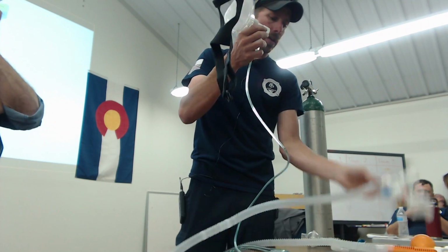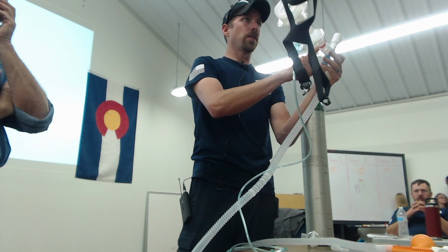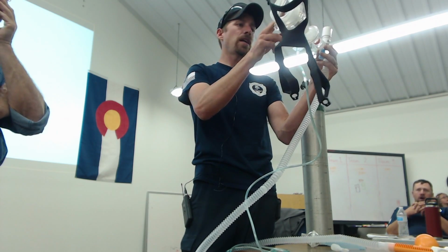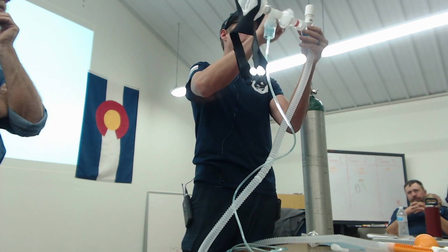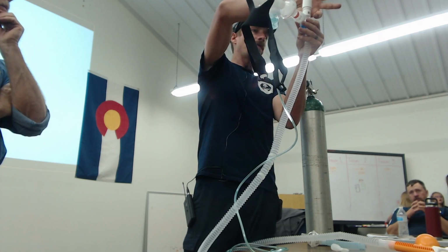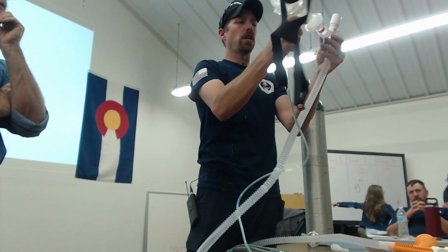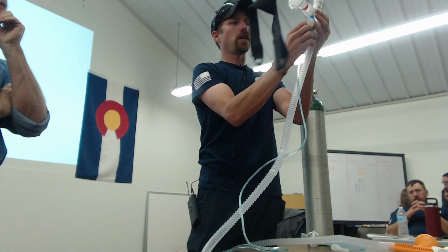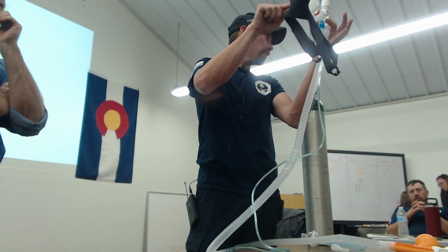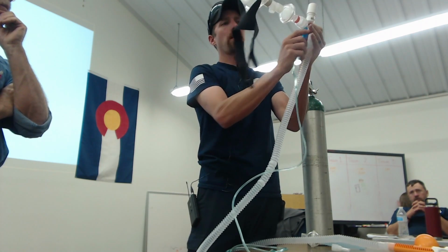On the other side of the filter, you don't want to put the nebulizer on the back side of the filter, otherwise you're going to filter all your medication. So you've got to make sure that it's on this side with this particular setup. With the other CPAPs, where the HEPA filter is right underneath the PEEP valve, you won't need to do this. You can actually put the nebulizer straight into the nebulizer port because the filter will be up here and you won't filter your medication. So that's just a nuance of this particular setup, that you're going to have to add it on the other side.